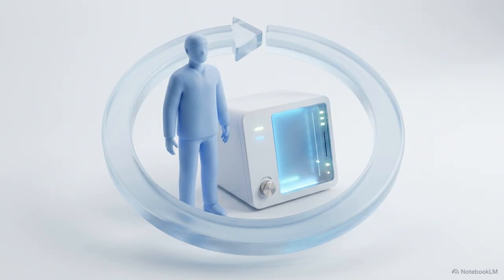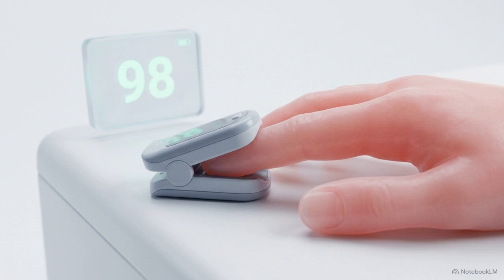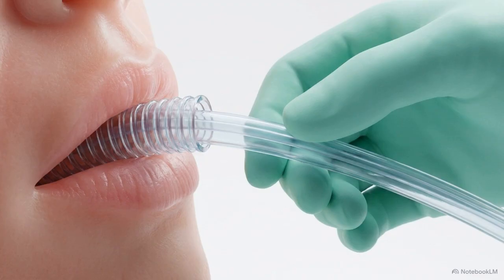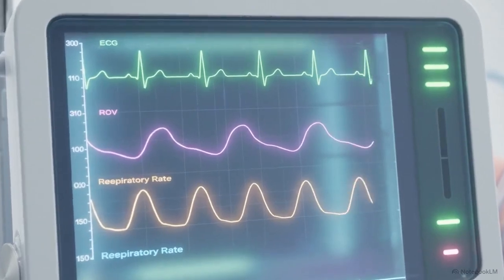To mitigate these complications, the bedside practitioner must execute a continuous clinical operational loop. This requires aggressively monitoring vital signs, drawing arterial blood gases, and verifying oxygen saturation independent of the machine's internal telemetry. It involves the mandatory execution of the VAP bundle, ensuring adequate circuit humidification, and performing necessary airway suctioning to clear secretions. The bedside clinicians must prioritize the patient's physical presentation over the numerical data on the monitor.